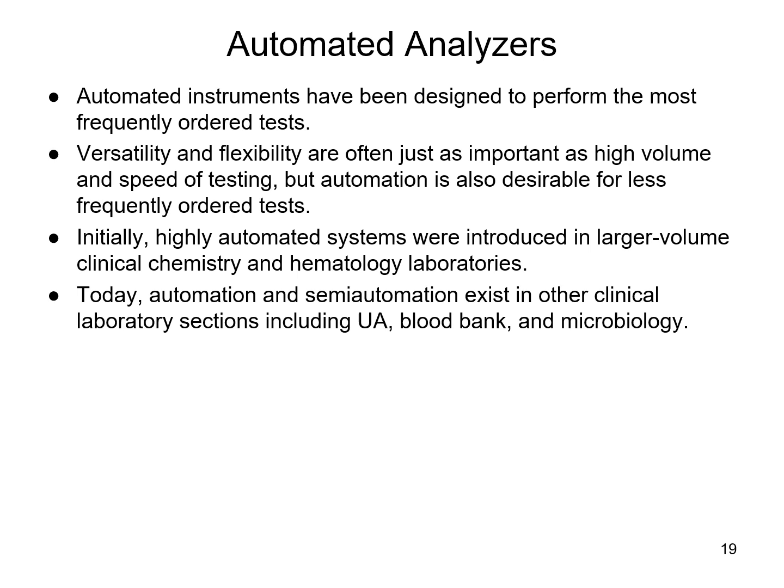Up until several years ago, urinalysis microscopics were always done with a tech looking at the microscope, but over the years they've developed new technologies that are able to take pictures of those cells and kind of categorize them for urinalysis so that the microscopic is actually done through automation now, and it allows the tech to review those images and make sure that they're categorized properly.